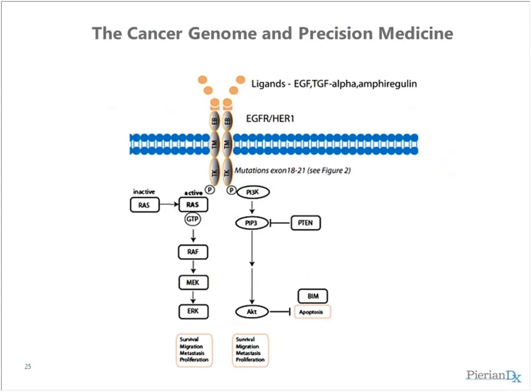In this slide, I'll just highlight one pathway. This happens to be the pathway for EGFR, just to show you and highlight the point that there are multiple genes with all kinds of variants in them that act either in a singlet or in conjunction with each other, and maybe in conjunction with other pathways and so on, that we used to be able to do one at a time, but it's just become way too complex to do that.